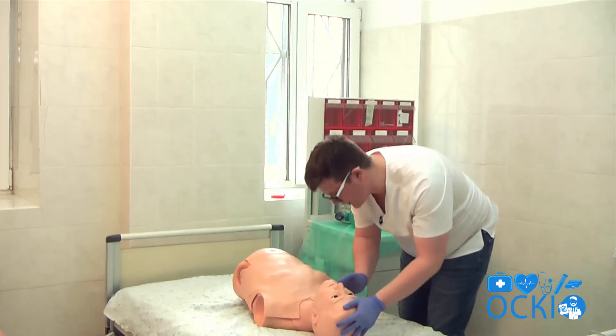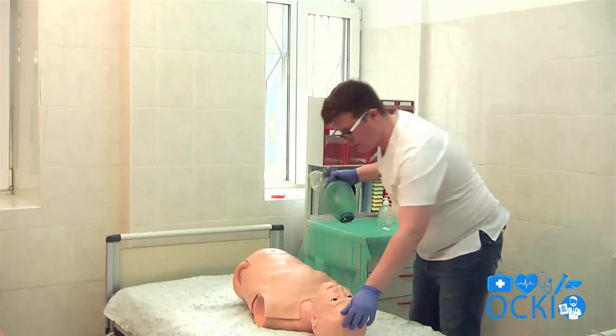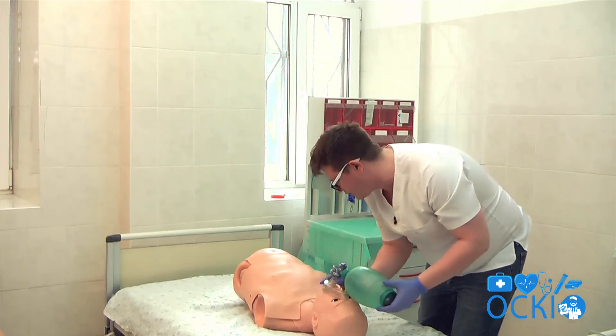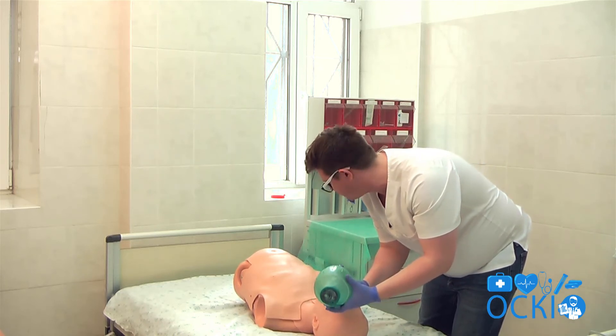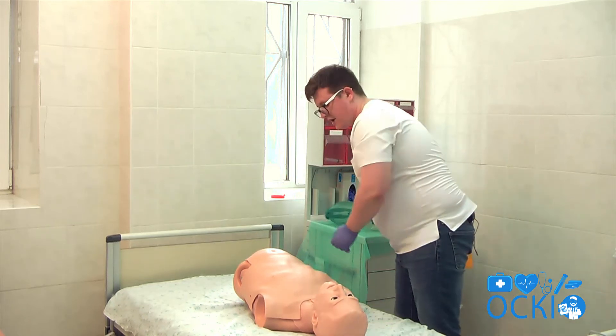After 30 compressions, perform two breaths: open the mouth and deliver the breaths using an Ambu bag, checking for chest rise with each breath.